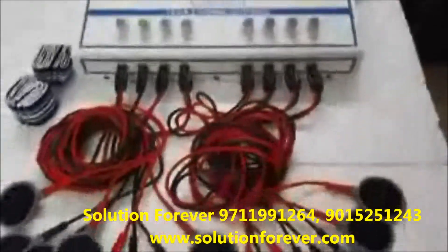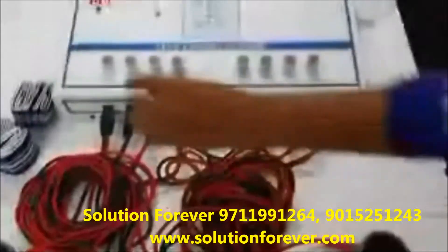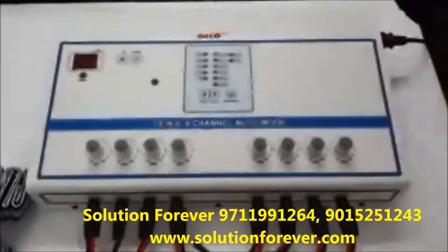After treatment is completed, make all the intensity knobs back to 0 and switch off the machine. The demo is completed.